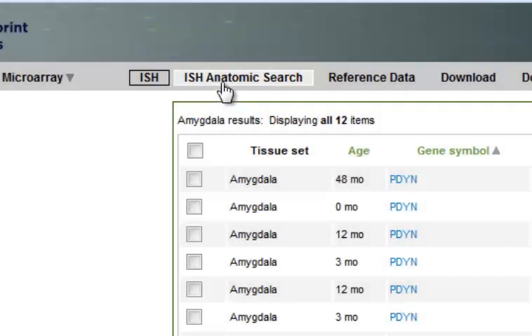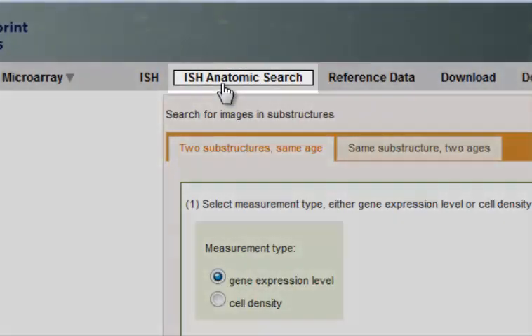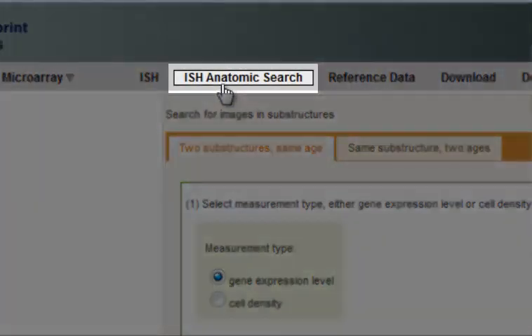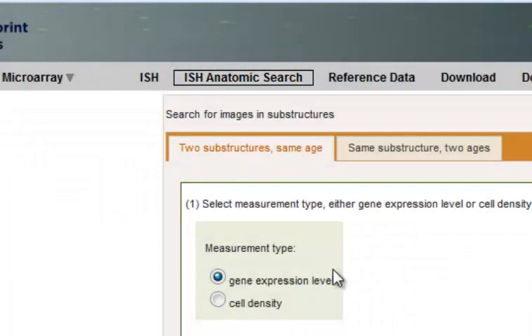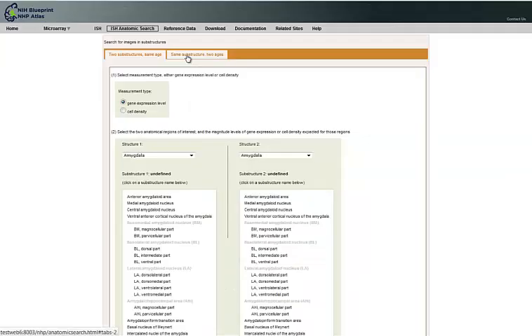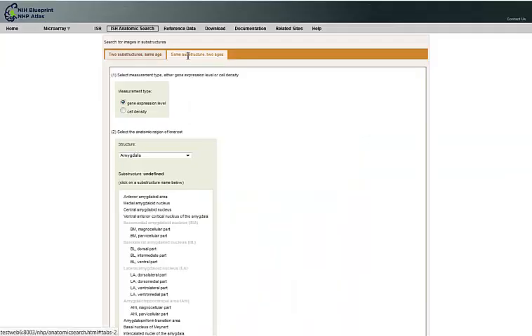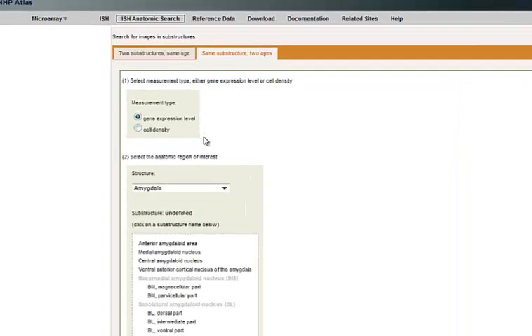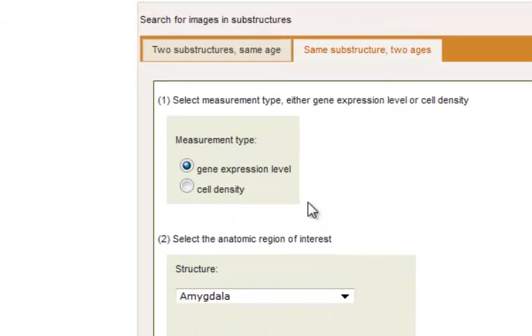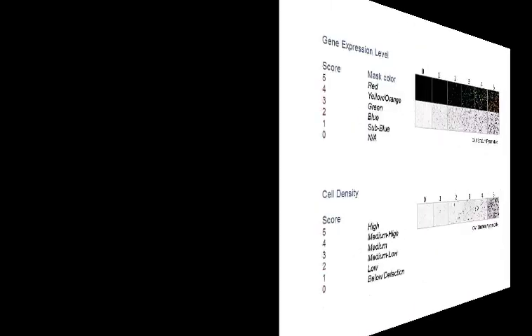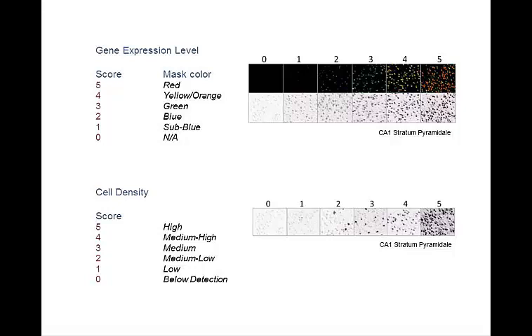I also want to demonstrate how to use the ISH anatomic search features. You'll first have to determine if you want to compare two substructures in the same age, or if you're comparing the same substructure over two ages. Both searches are relatively similar, so I'll demonstrate using a single substructure at two ages. Then you'll need to select the type of ISH signal, either gene expression level or cell density, both of which were manually determined by our neuroanatomists.